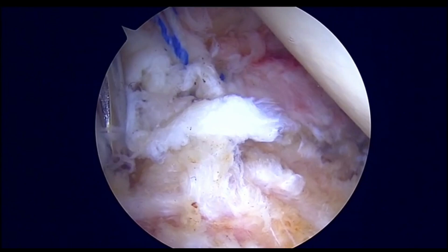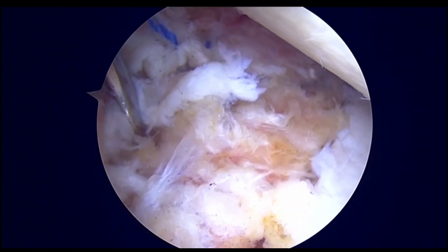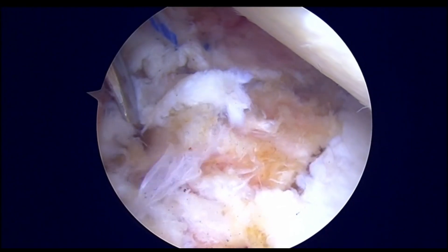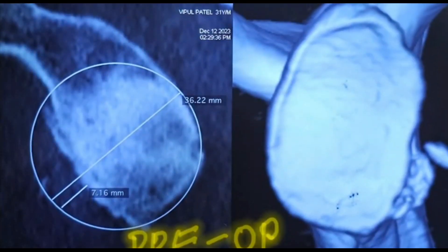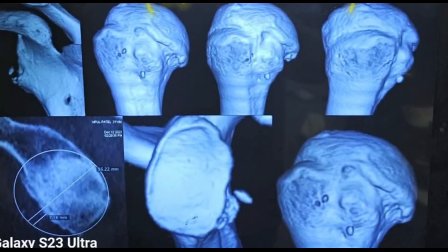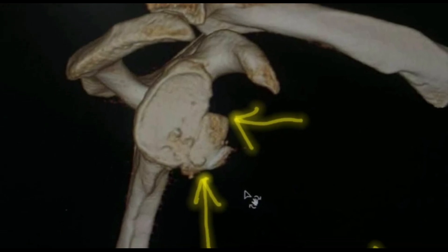The labrum will now be repaired with multiple sutures. You can use knotless or a permutation and combination of knotless and knotted sutures. You can use a push lock anchor to close the labral complex over the bone, so that the bone becomes an extra-articular structure. You can see that the pre-op defect is very nicely closed with the bone block on the anterior inferior aspect, and a very nice bone block reconstruction is achieved.